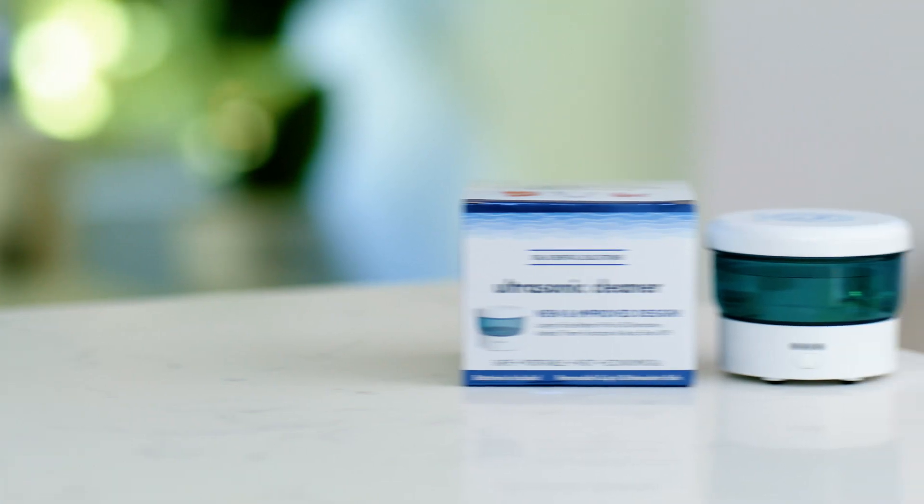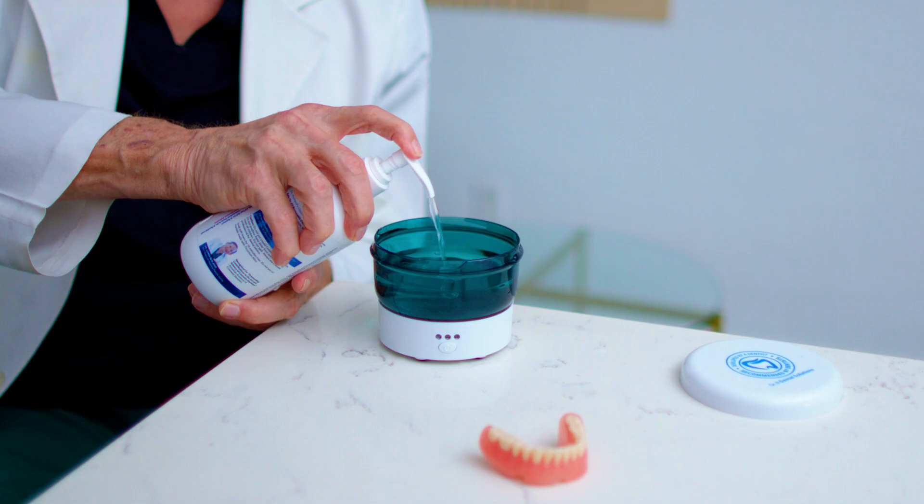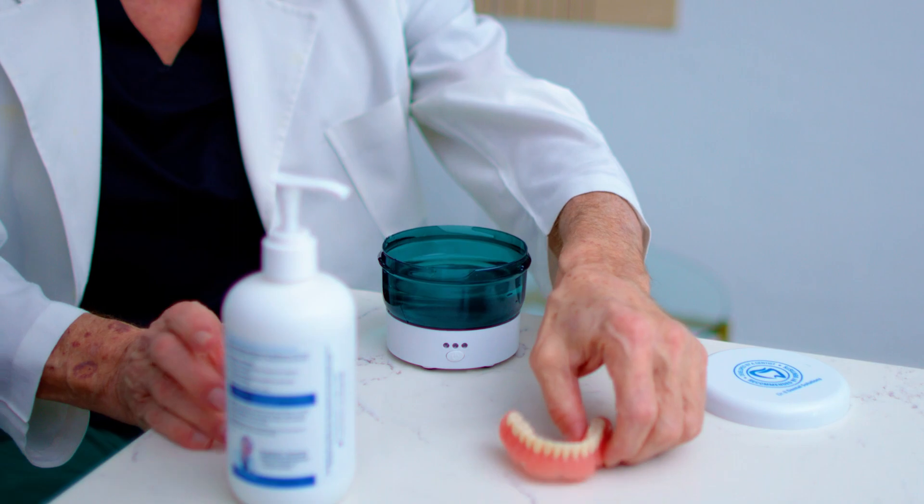We also have the liquid crystal and the ultrasonic. It's essential that you clean and disinfect your dentures for five to fifteen minutes every day.